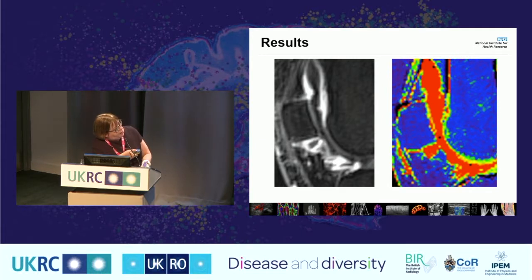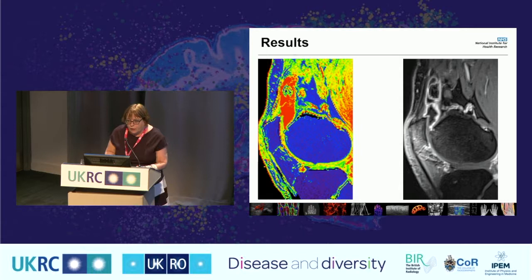But actually what's happening here is when we look at the T1 image, red is fluid, and this area here doesn't correlate to synovitis, it actually correlates to synovial fluid. So for some reason, this person is actually perfusing their gadolinium from their synovium into their synovial fluid at a higher rate than we would anticipate. And if we were looking at this to say what is the burden of synovitis for this patient, we would overestimate, because we would say this was synovitis, when actually it's only the outer rim that is synovitis and the middle part is synovial fluid.